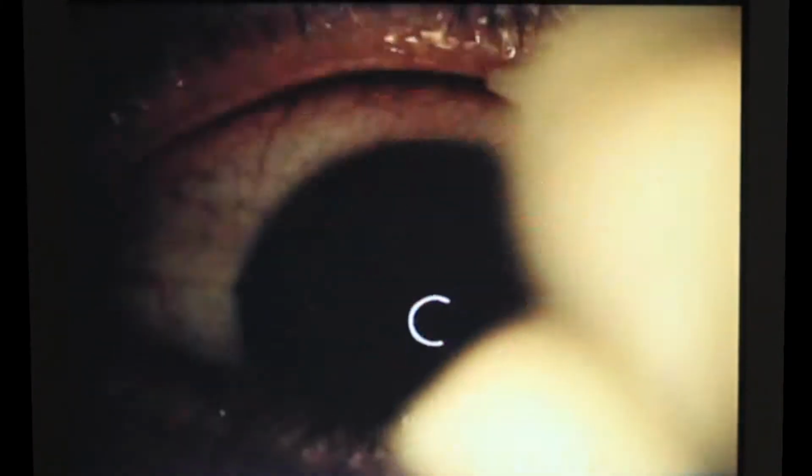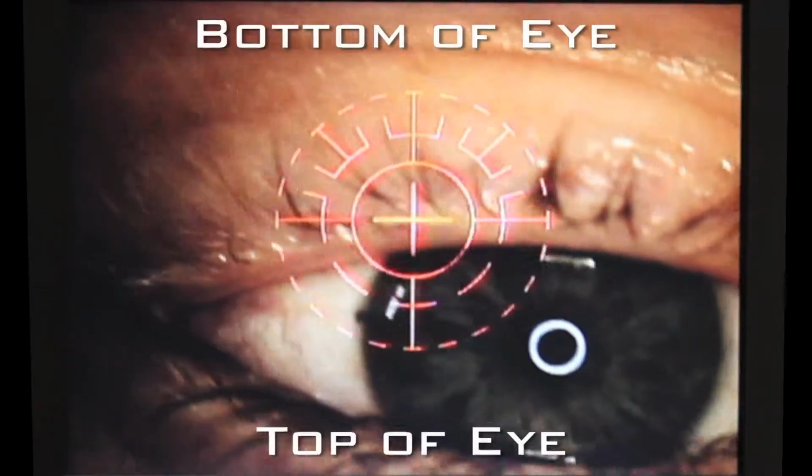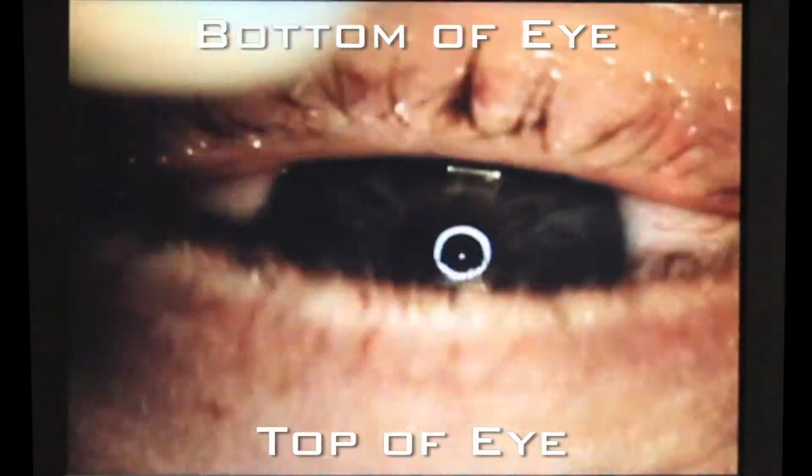It was eye LASIK. Alright, so I decided to give you the doctor's point of view. So this is my eye, upside down. I guess up to the doctor is towards my mouth. I guess my forehead is down below the screen. This is the worst part of the whole thing right here. They put the Super Clamp-O-Matic Eye Opener 3000 on you here.